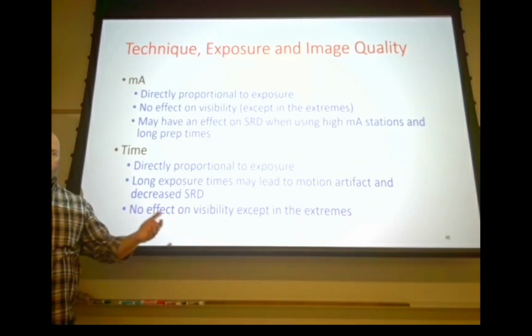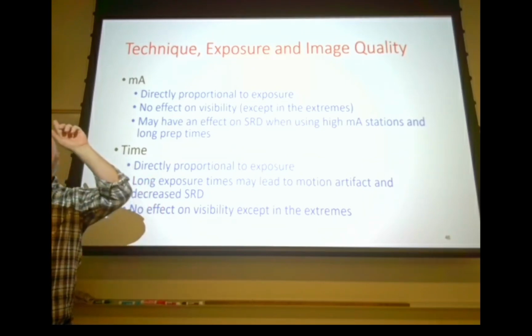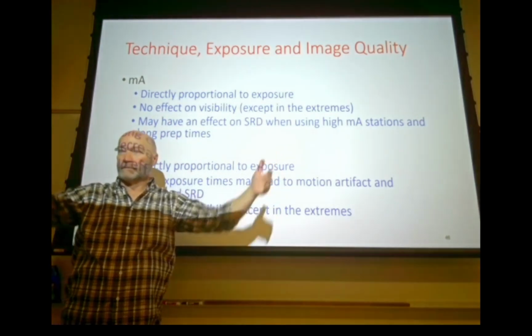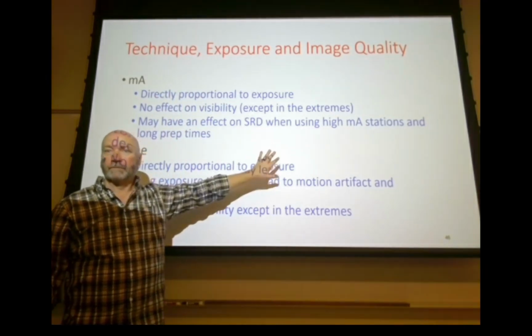And you really kind of see multiple shadows because of multiple lights, and every one of those shadows is not clear. It's kind of fuzzy because our sources are 4 feet long each, right? So large focal spot, ugly shadow, small focal spot, sharp shadow, right?